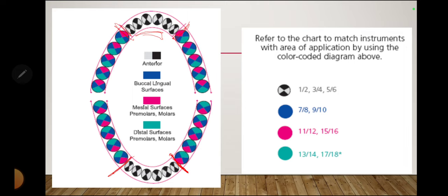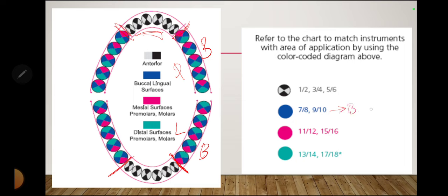Gracey curets 7-8 and 9-10, represented in blue in the diagram, are used for the buccal and lingual surface of all posteriors — and for maxillary posteriors, the buccal and palatal surface. So 7-8 and 9-10 are for the buccal, lingual, or palatal surfaces of posteriors.